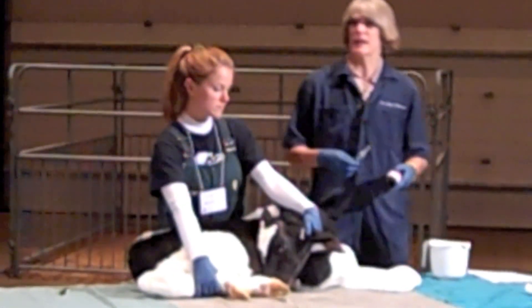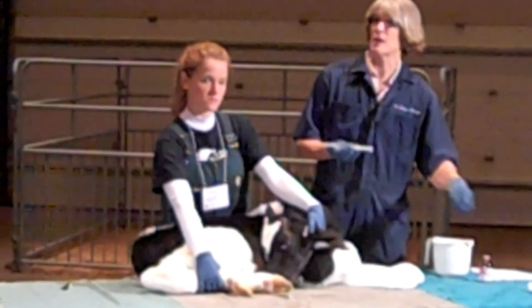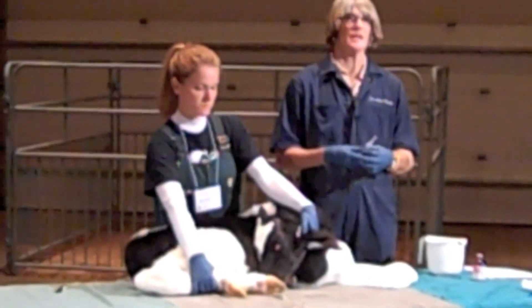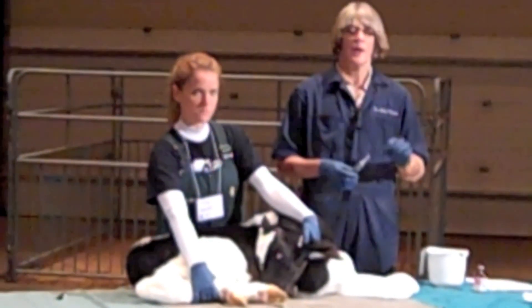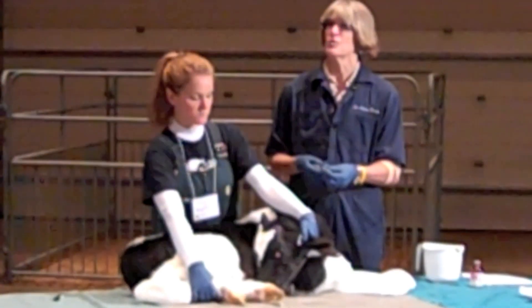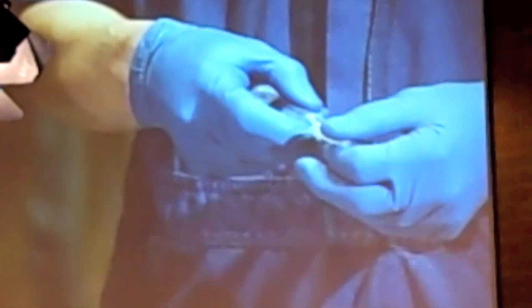The local anesthetic I'm going to use is lidocaine, and I'm going to draw the full dose that I need. I need two cc's at each of the sites that I'm going to block, just pulled into one syringe. I have a 22 gauge, very small one inch needle that I'm going to administer and show you where the nerves run.